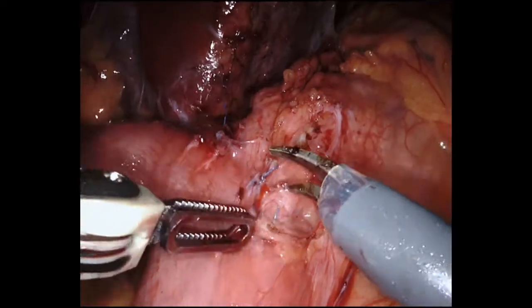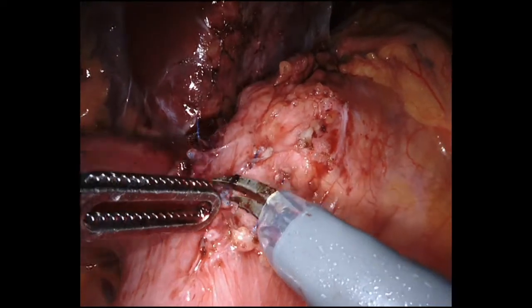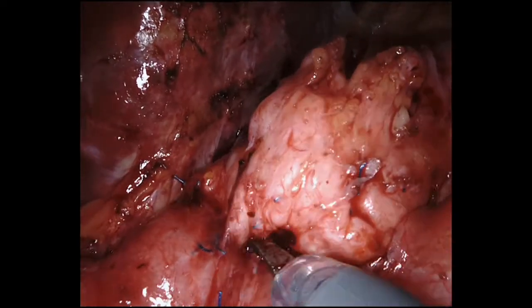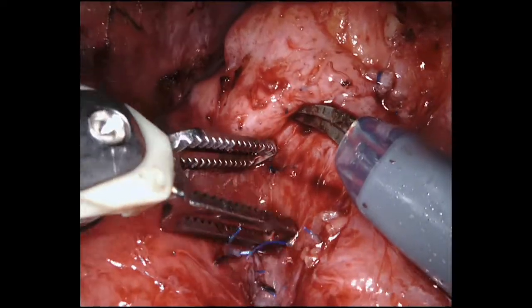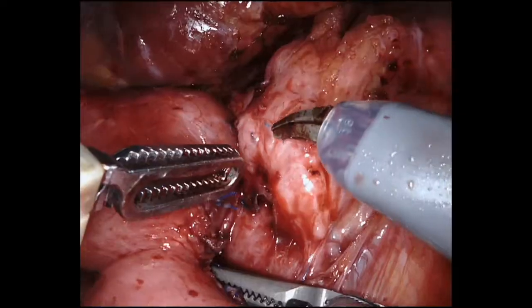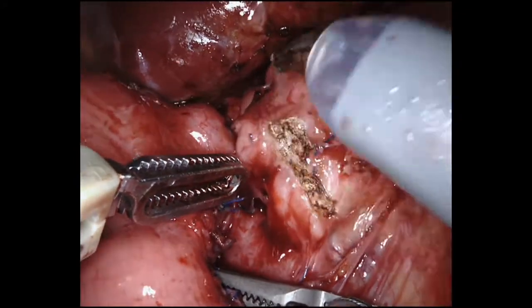The anterior layer of interrupted sutures is divided with scissors. The distal pancreas is separated from the jejunal loop. The posterior layer is identified and preserved. The next step is to resect the proximal portion of the pancreas in a pyramidal shape.